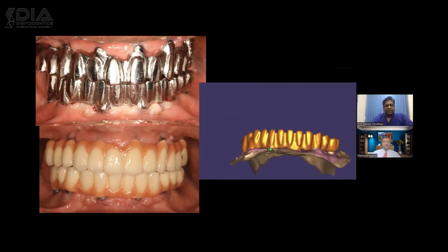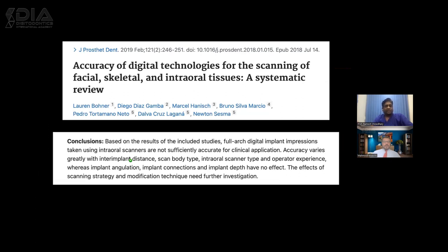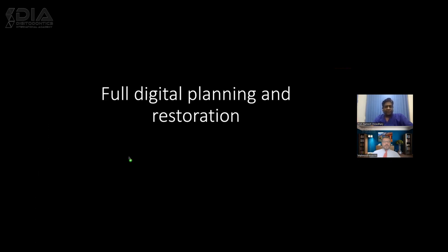So this was the same thing which we had after approval of these things. This has become a routine across the world today. Exocad has really changed the way we see the restoration before it comes to us in the clinic, the practice. And this is, of course, the end result for the patient. The patient was very happy, and even the margins, the fit and the self-cleansing areas can all be planned very nicely these days, friends. Before, it was a difficult thing.